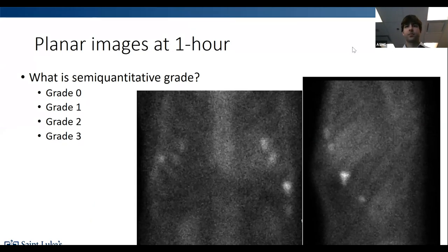One. People are saying one. Yeah. Great. So yeah, I think this is an interesting one because what else do you guys see here? Obviously there's focal rib uptake in several spots. So is this confusing things for us a little bit? If you look at the lateral, so grade one, you would say that this is not consistent with ATTR, right? On the lateral, and if there is myocardial uptake, sometimes you see this donut where the center kind of clears here. So you are wondering a little bit about this, if this is gonna end up showing myocardial uptake.